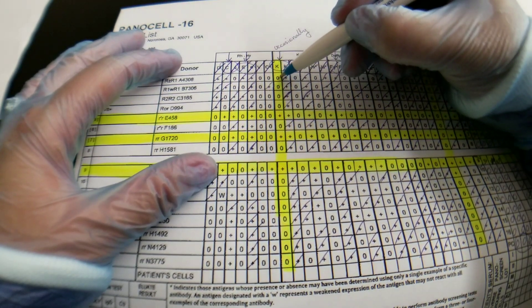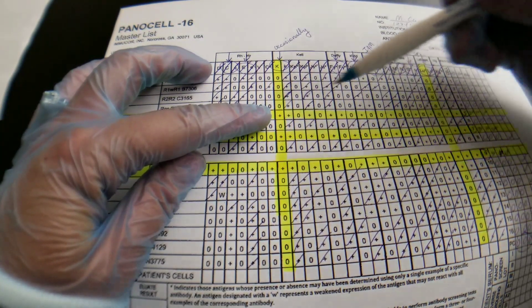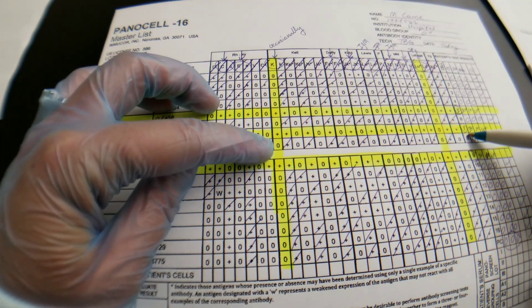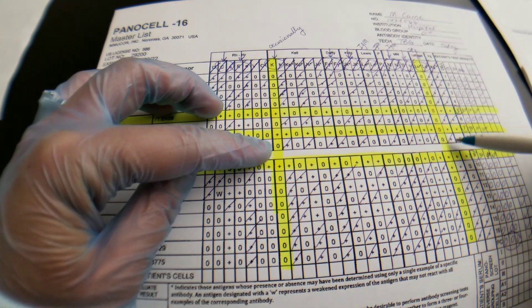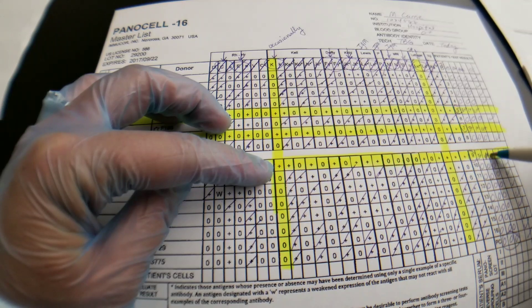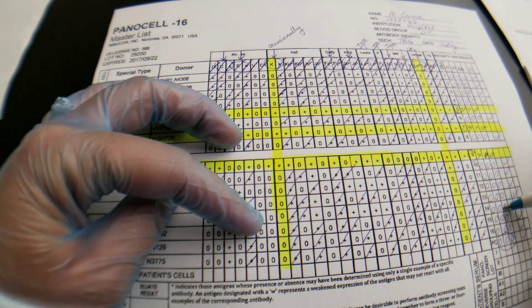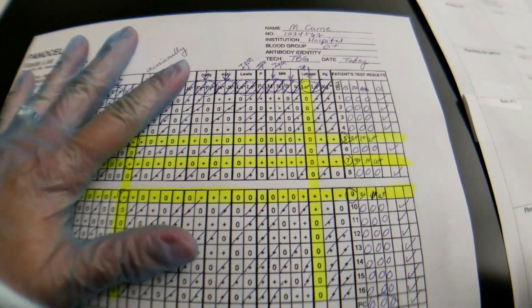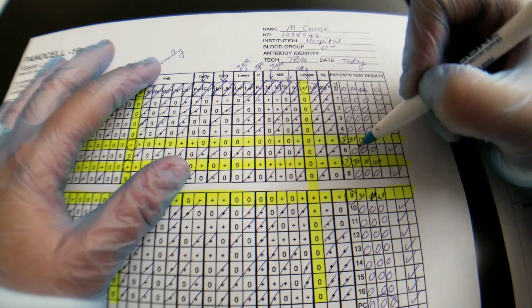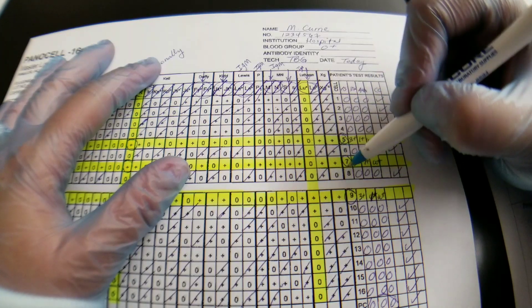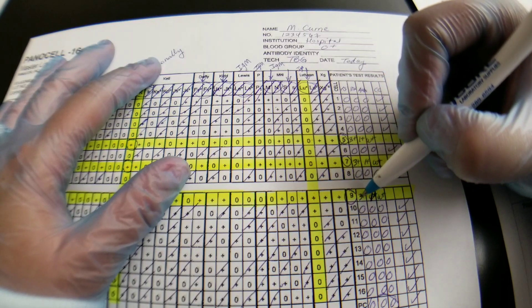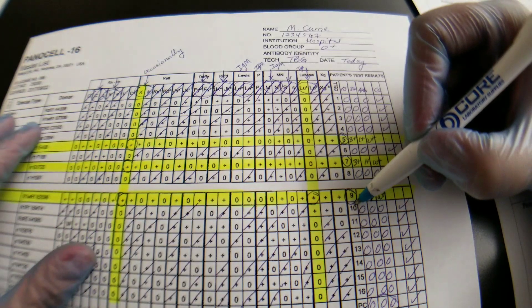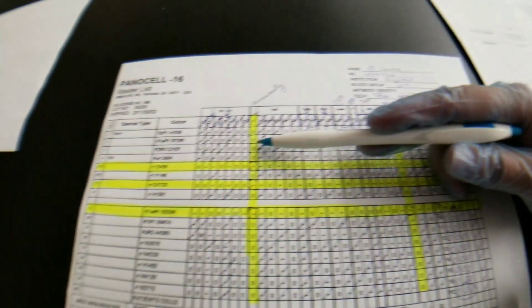So we have negatives in all the negative cell lines, which is right. Then we have a positive in cell line 5, okay. We have a negative in 6, which was negative 2. And then we have a positive in 7, which was all positive. Then we have a negative in 8, which was negative. And positive in 9, which was positive. And then everything else is negative, like it was over here, okay. So think on that one. So we have positive, positive, positive. All right, now let's look at Lutheran A. Lutheran A, there is no reaction in the positive line. Hmm. No reaction in the positive line here too, but a reaction in the positive line of 9. So this one does not match the pattern of 5, 7, and 9. So as you guessed it, this Kel is actually the one that I added.